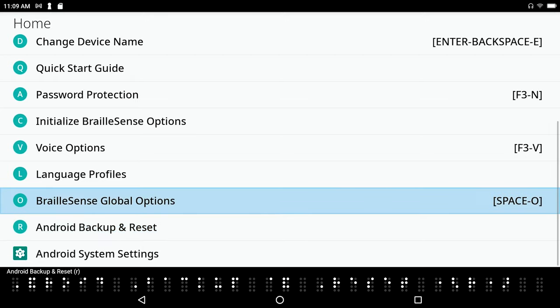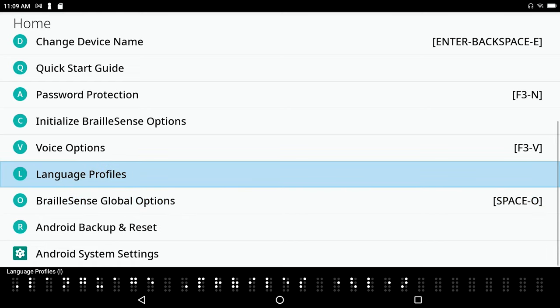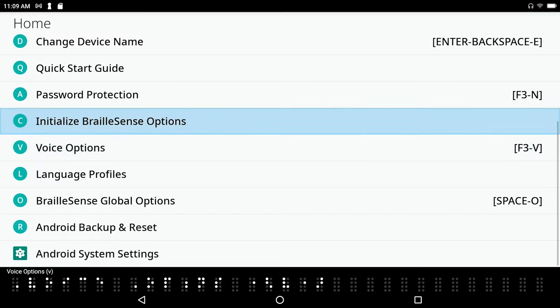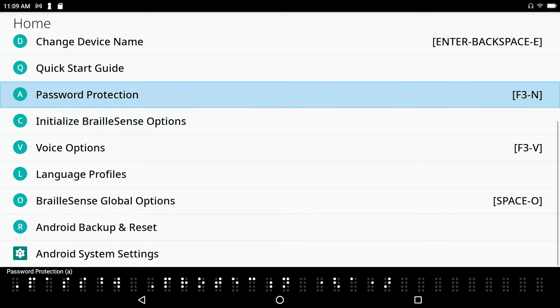Braille Sense global options, oh there's Braille Sense global options, language profiles L, voice options V, and I just keep pressing space with dot 1 to move up.